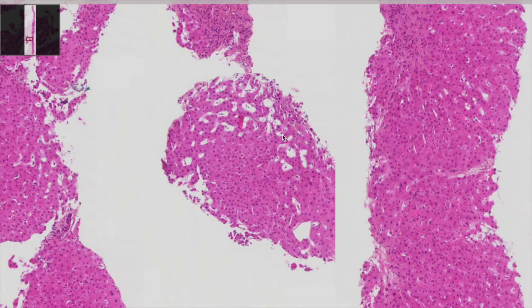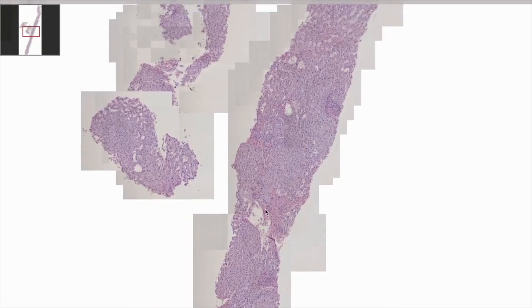So to further characterize this sample, we can do some additional staining, and we will see first the Sirius red hematein staining. You have here this staining that stains the fibrosis in red. It's an important staining because we remember the question from the clinician: is there fibrosis, cirrhosis? And you can see here at low magnification that there is not really significant fibrosis, so at least not cirrhosis. You don't see any fibrotic septa.